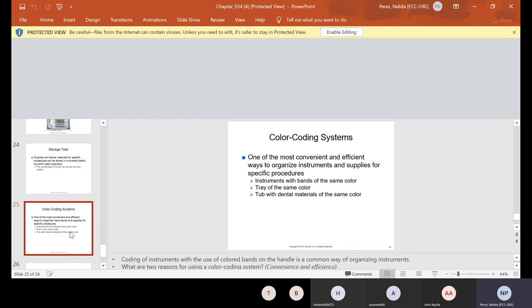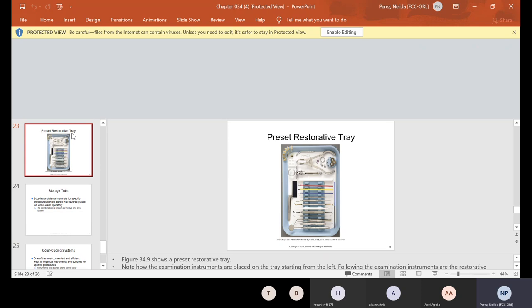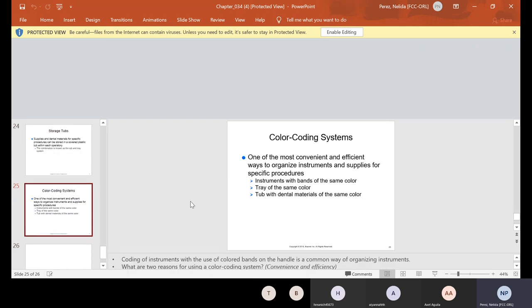Now there's also something called the color coding system. This is one of the most convenient and efficient ways to organize instruments and supplies for specific procedures. You put bands of the same color on those instruments. So these instruments don't have any, but in your Kindle, there might be a picture. You would put a specific color, let's say for amalgam. So all the instruments that have a blue band on them, meaning that they are amalgam instruments, all instruments that have a yellow band on them, they'll be composite, all instruments that have a green band on them, they might be endo and so on and so forth.